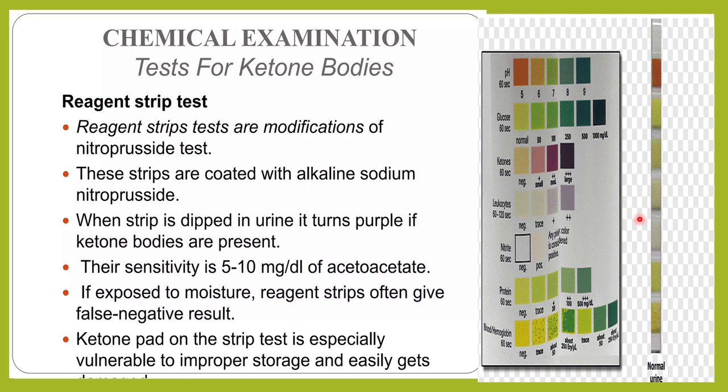Exposure to moisture can give you a false negative result. Even though the patient has ketones, it can give you a negative result. If the strips have been stored improperly, then also you will get a wrong result. So you should be very careful in storing the reagent strips, and you should follow the manufacturer's instruction.